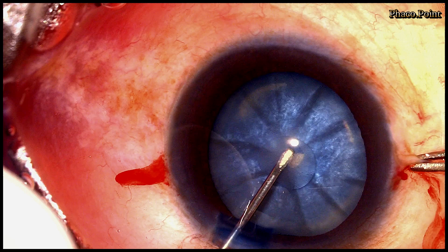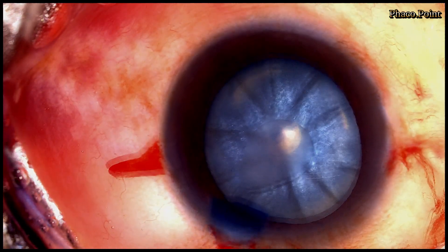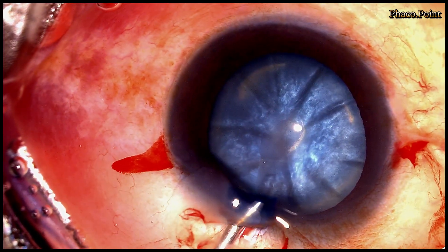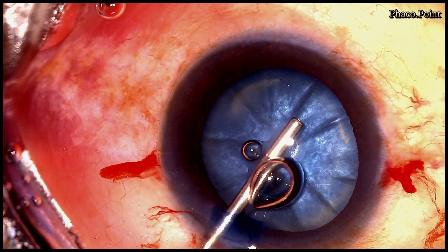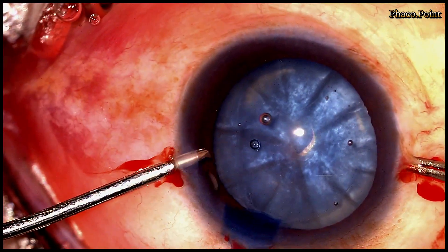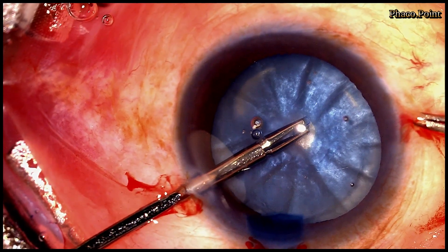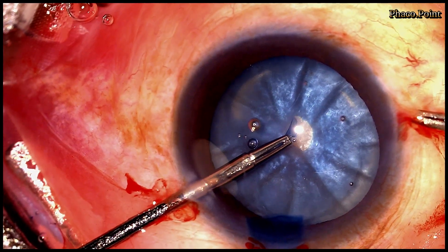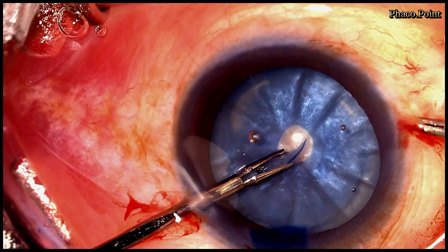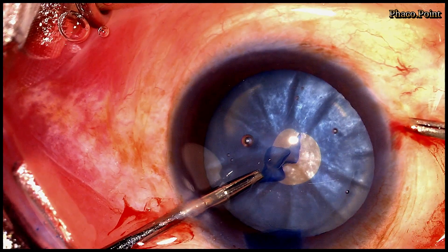We now proceed with the double rhexis. As I try to make that initial circular cut, there is some milky fluid coming out. This hampers visibility, so I need to go back into the eye, remove that fluid, and inject some more dispersive viscoelastic into the anterior chamber to flatten the anterior capsule. Having done that, with the help of an intraocular forceps, I proceed to convert this half tear into a small circular opening in the anterior capsule.